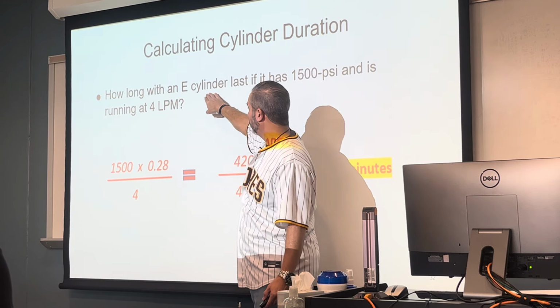All right, let's talk about another one. What about liquid oxygen? Liquid oxygen, again, stored cryogenically. If we're going to convert that liquid into a gas to provide oxygen to our patient, how long will it last? The calculation has a little extra step to it.